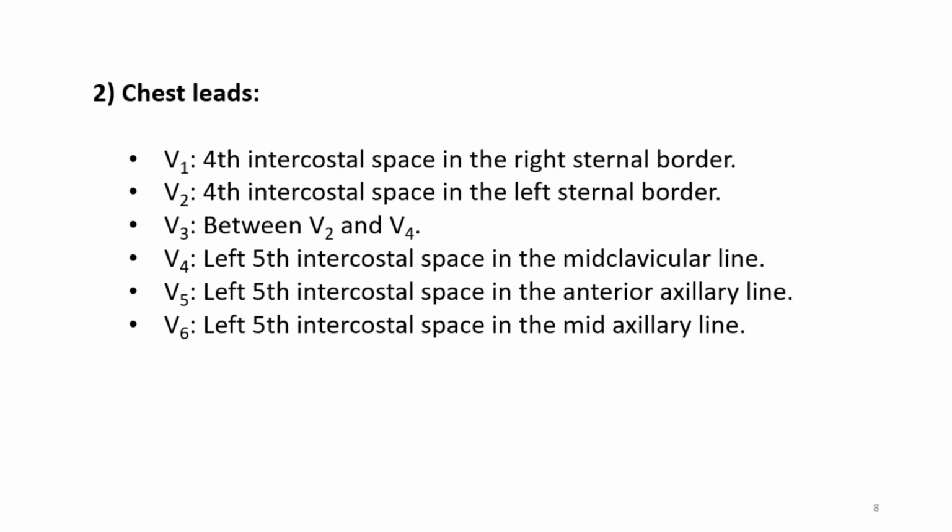Chest leads. In chest leads again there is an exploring electrode, and the electrodes coming from other extremities are combined after 5000 ohms on the other side.